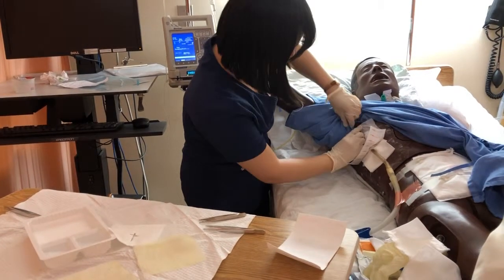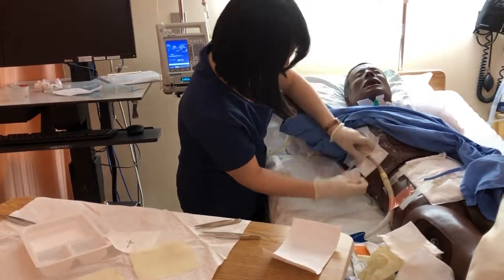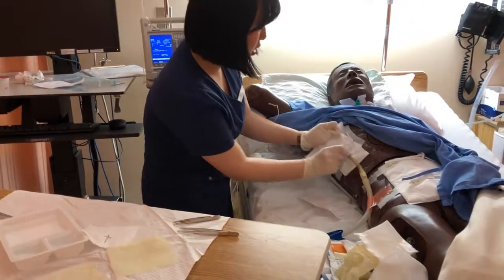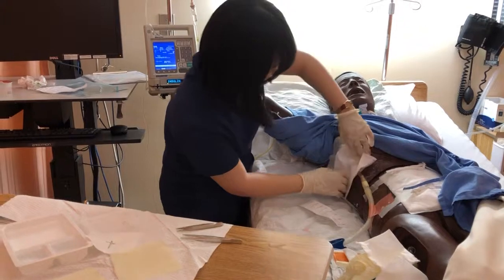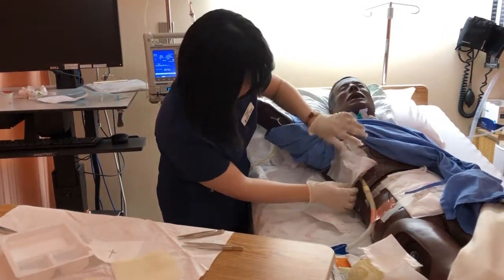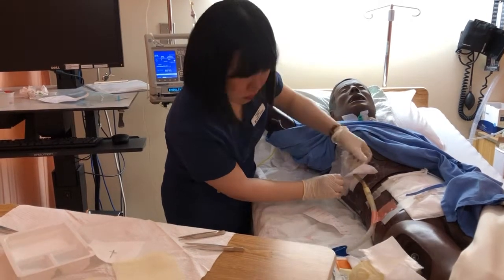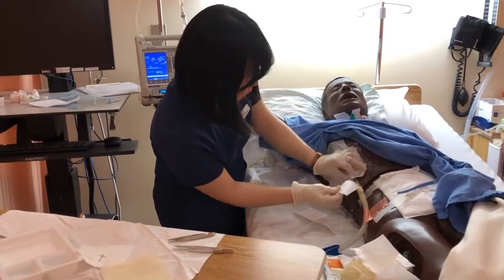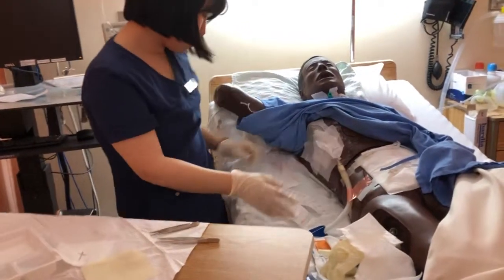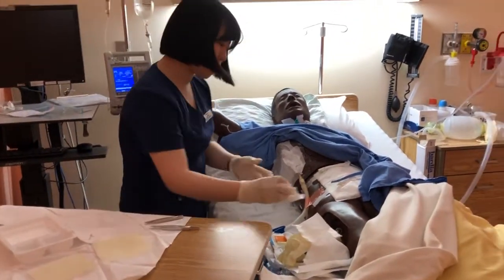So for the video, I forgot to mention some things. You're gonna date and time your dressing as well. And make sure you're making a little tent from the tubing. So I'm gonna check the tubing integrity again.